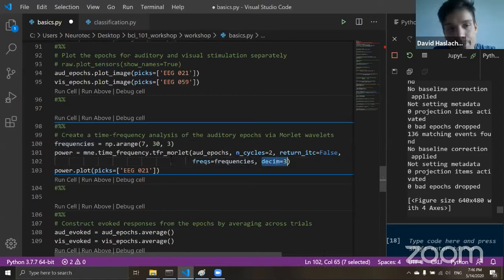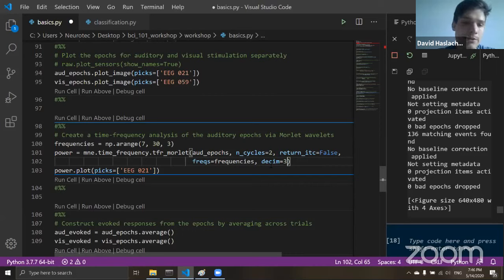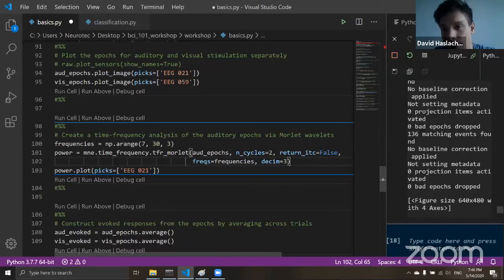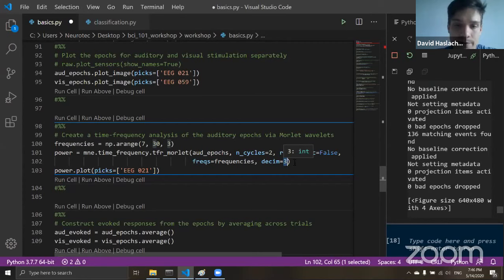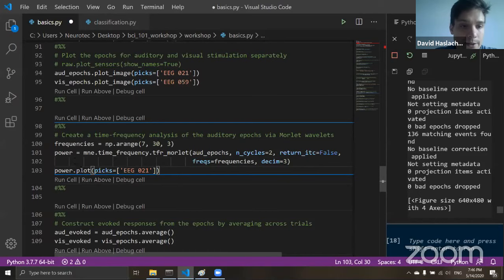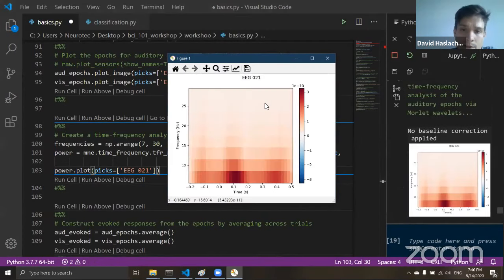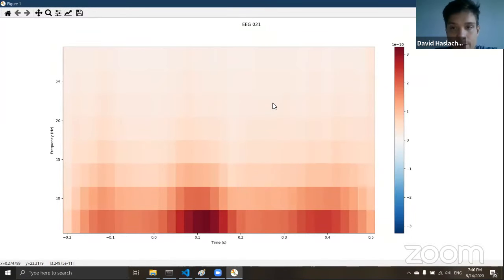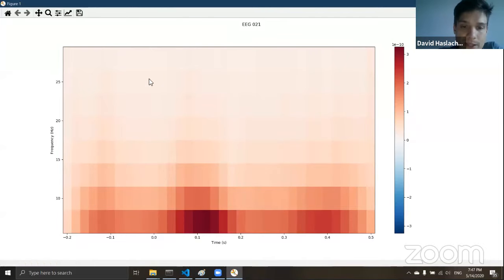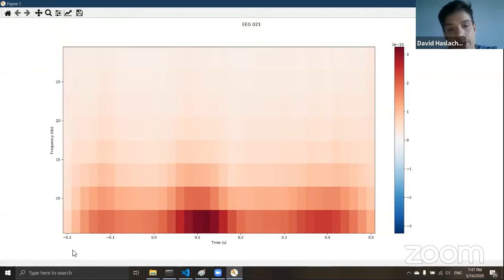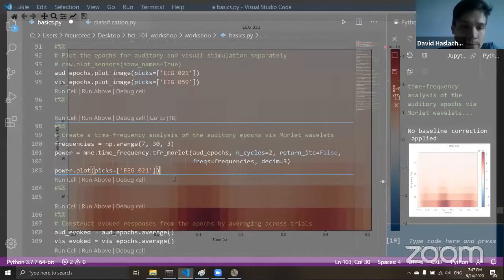We can also decimate the data to reduce memory — decimation with value three means we take every third sample to reduce the memory load. Then we call the plot method for one of the sensors to look at the time-frequency decomposition. After time zero at around 8 Hz — the theta band — we see an increase in power or amplitude which then drops off again. On the y-axis are different frequencies, on the x-axis is time.